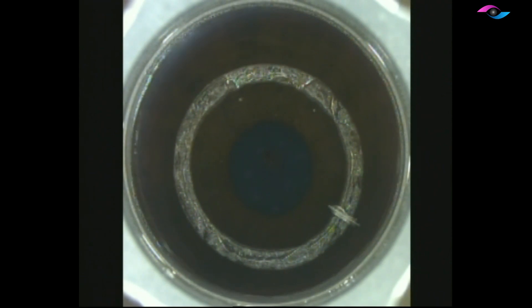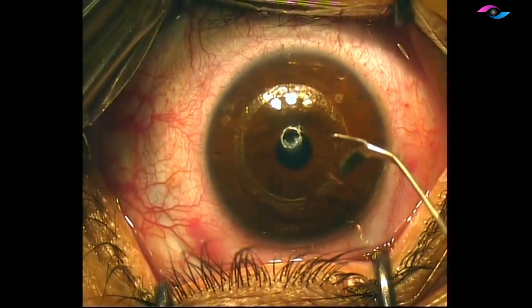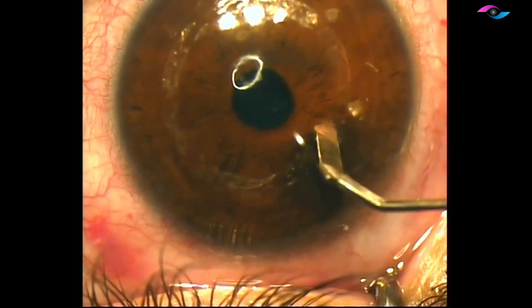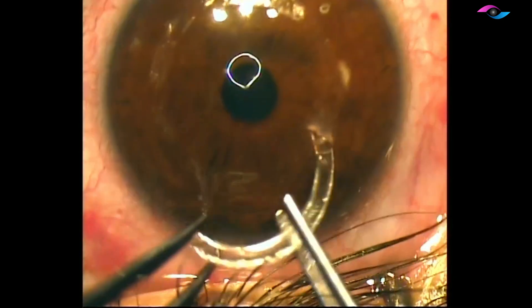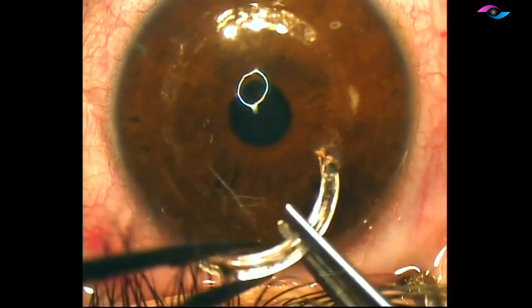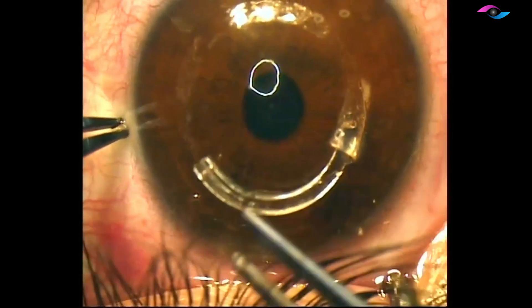We are now making a cut, and from this cut we are going to enter and put in the INTACS channel. This is a special instrument used for opening up these channels. We are first opening up both channels on either side. The trick when placing these INTACS segments is to first go vertically down and then go parallel to the cornea — this is how we can enter the channels effectively.